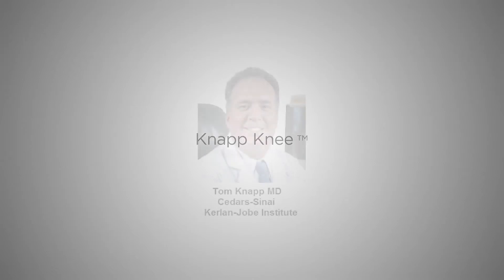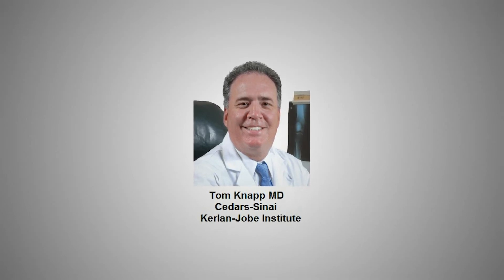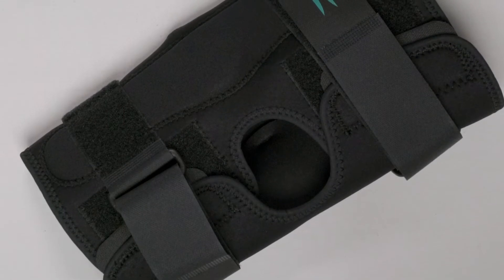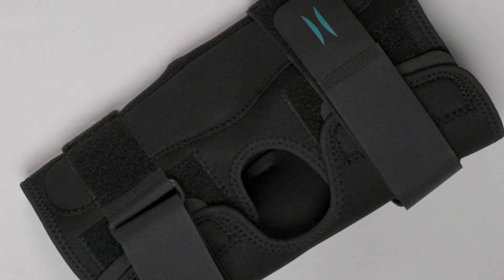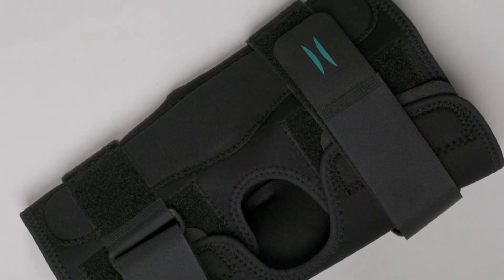We represent Healy Weber, and they have taken the anterior closed knee brace to the next level. Years ago, John Healy was approached by Dr. Tom Knapp to build a knee sleeve that closed in the front for his patients who were having a hard time pulling them up. Add a couple of hinges and you have the first anterior closed knee brace on the market. Now, 20-plus years and maybe 10 iterations later, we present the Knapp Brace.